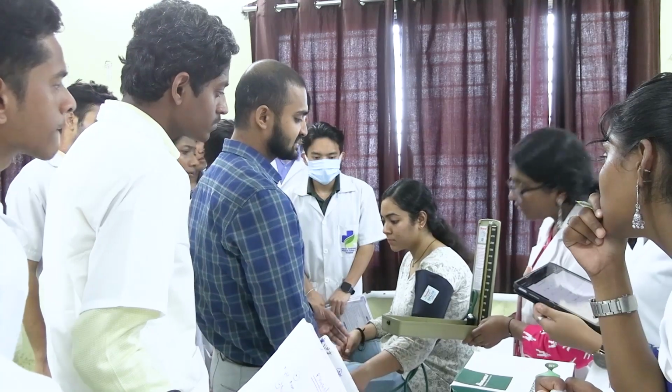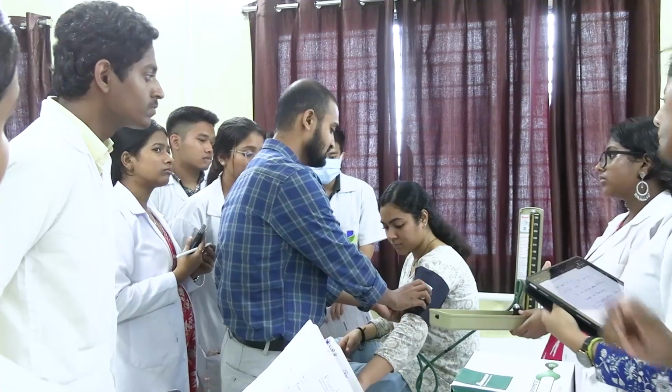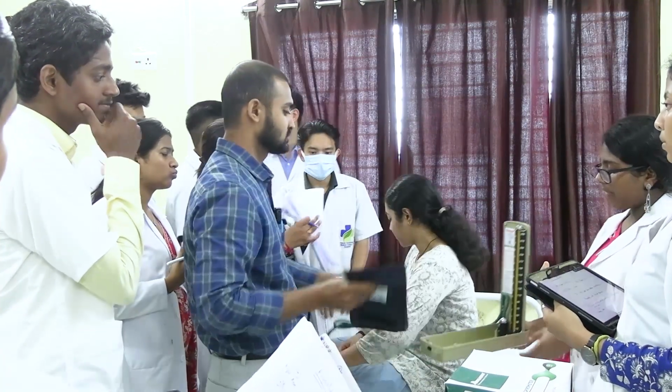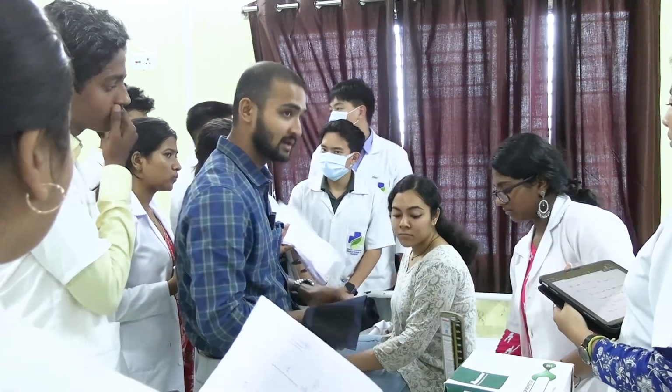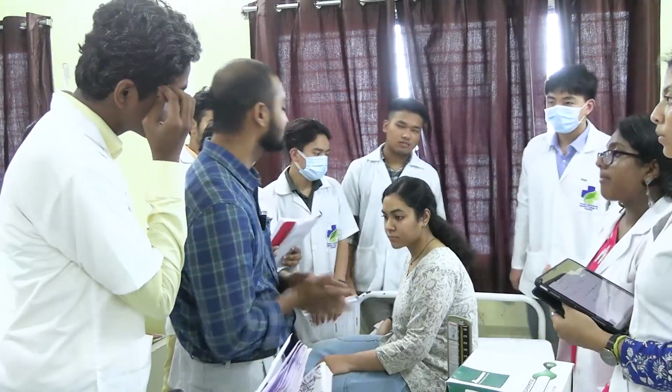So around 96 mmHg I am getting her systolic BP. Okay, so this is the palpatory method. Okay, so what is the advantage of palpatory method?